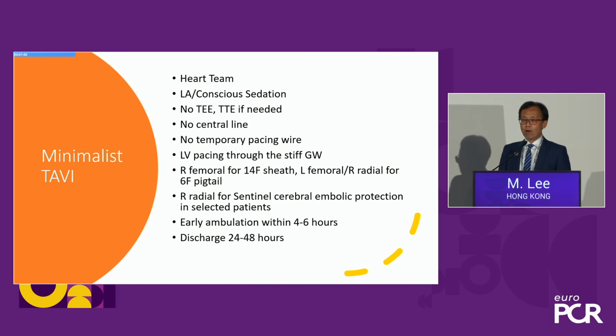So now we are all practicing minimalist TAVI procedure. When we are considering young patients, this is especially important. It should be a much simpler procedure than before. Local anesthesia, no TEE or echo anymore, no central line.